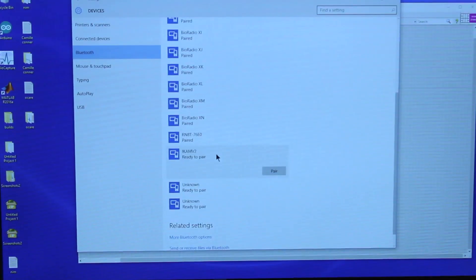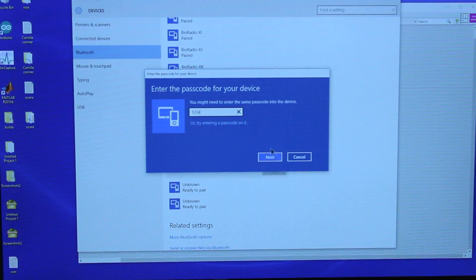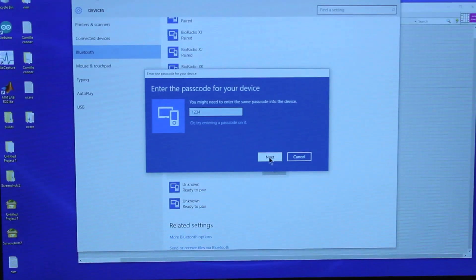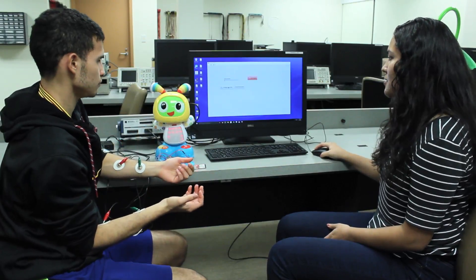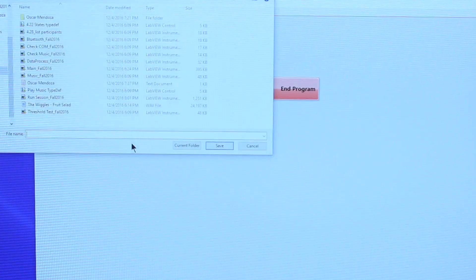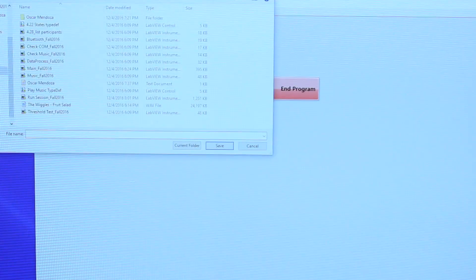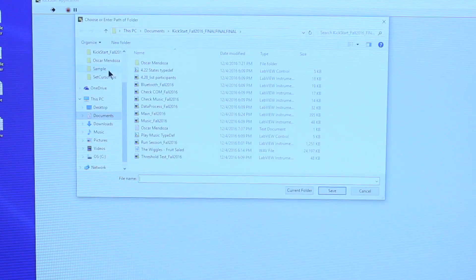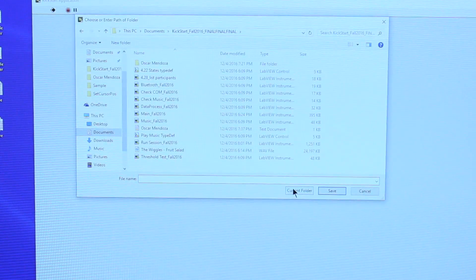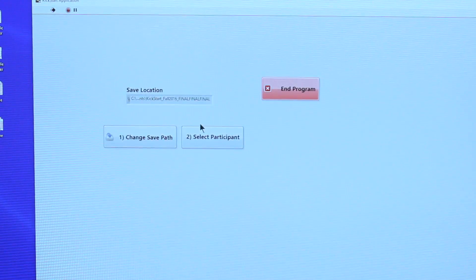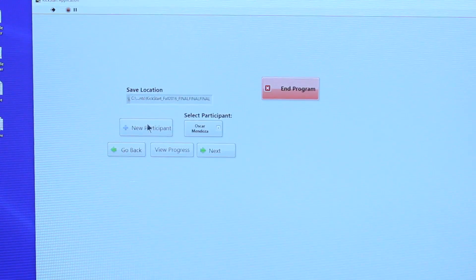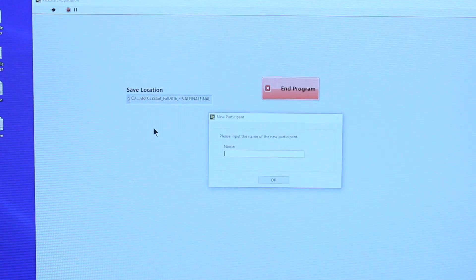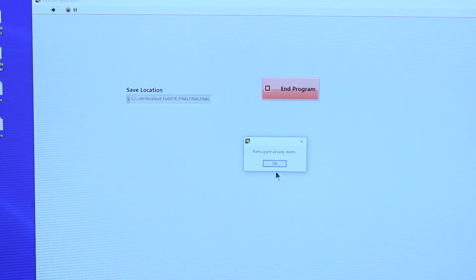The first thing I'm going to do is choose where I want my patient information to be saved. Next thing, select participant. If I were a new participant, I would click this button, but since Oscar is already in the system, we choose him from the list of patients.